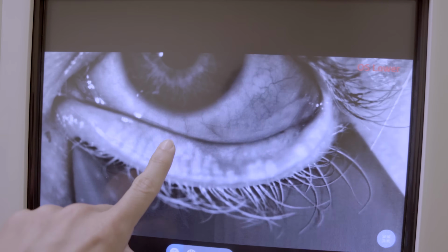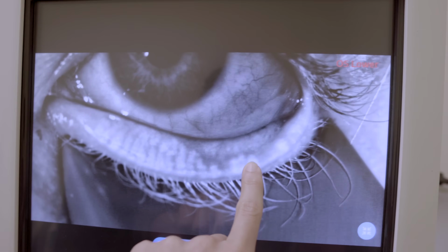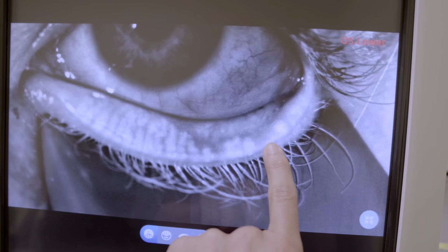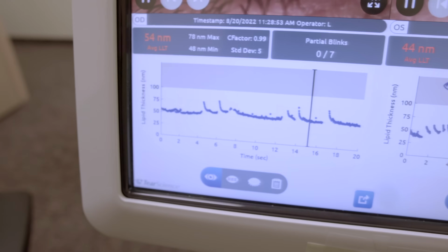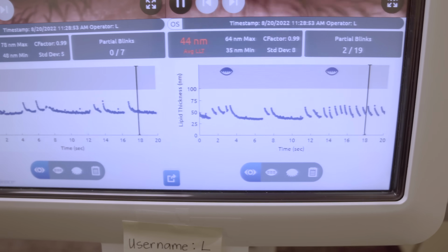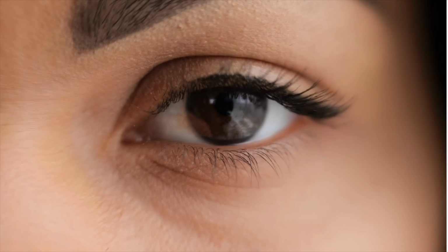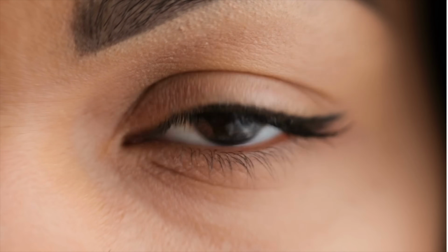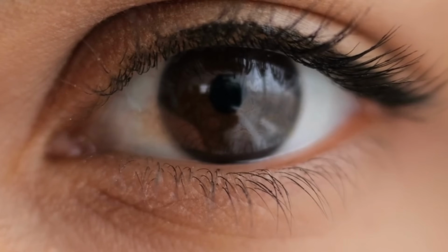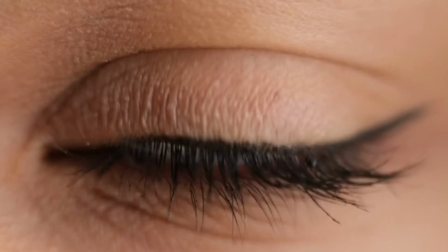Now, the purpose of scanning the oil glands and getting this meibography really serves two purposes. One is to show us how many glands are there and if they're inflamed or if they're in trouble. And two, the instrument also takes an active measurement of the oil layers on the tear film itself. And I personally just love looking at the images of the lipid layer itself because you can see this cool rainbow color on the front surface of the tears, which honestly reminds me of seeing gasoline or some other type of fuel floating on top of a puddle on the road or something. But being able to see those oil layers active on the top of the tear film is very powerful.